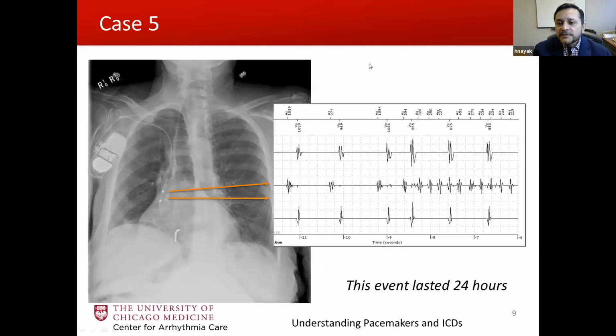So here was the remote interrogation finding. You can see here that this is a right-sided defibrillator, a device manufactured by Biotronik. Because of his bad lung disease, his heart is just shifted over. This is the ICD lead, and this is actually a virtual bipole that's floating in the right atrium. This virtual bipole allows the defibrillator system to sense what's happening in the atrium.